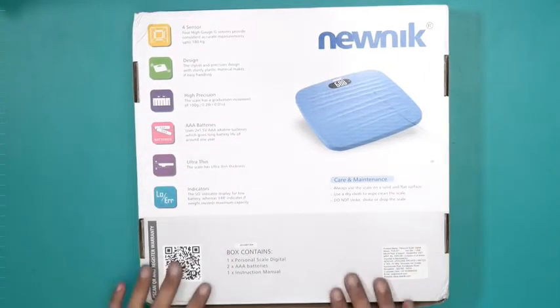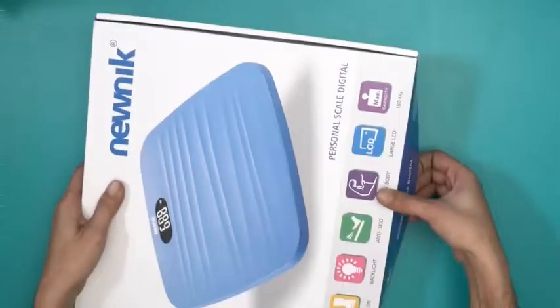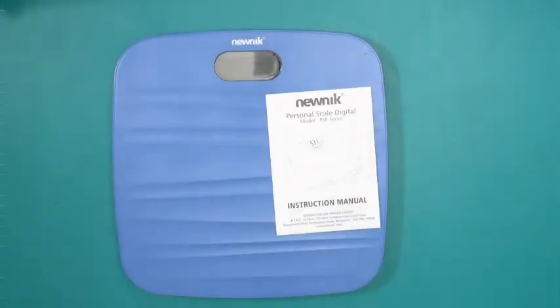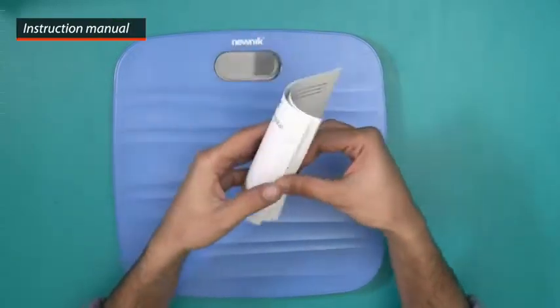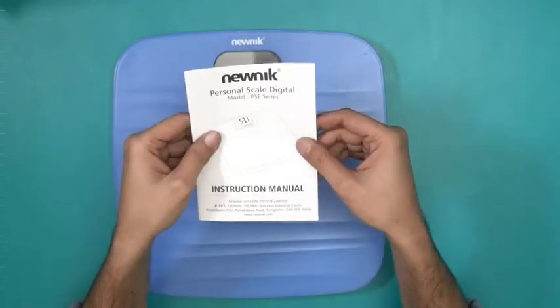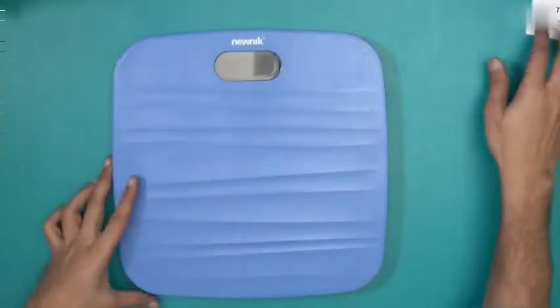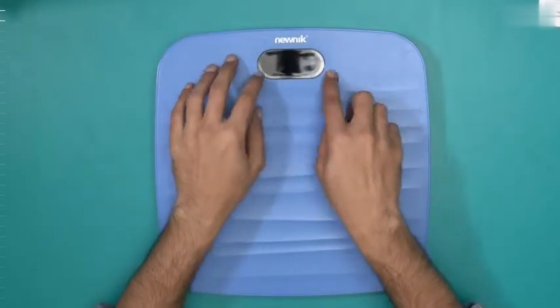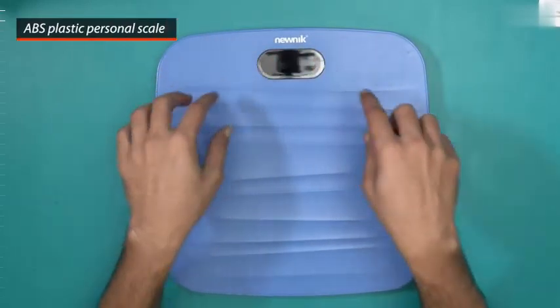I will just open this box and show you what's inside. This is what you'll find inside the box. First up we have an instruction manual for the PSE series — everything that you want to know, just read this up and you will get to know them. And this is the PSE201 weighing machine. This is the LCD display monitor for this weighing scale.